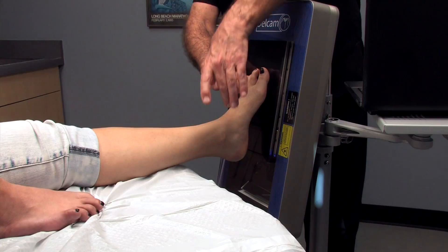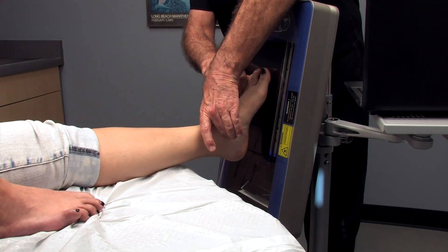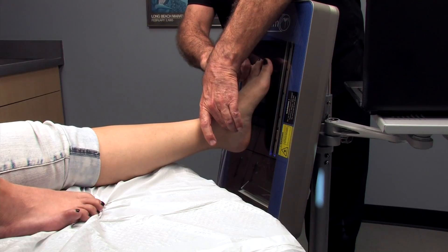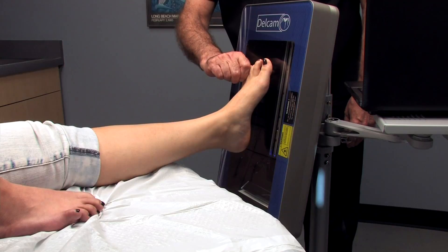I'm going to go ahead and just reach over, palpate the talus, find subtalar neutral just as we always do. In this case, we're going to grab the fourth and fifth toes and lift and load the foot just as we would in a neutral suspension cast.